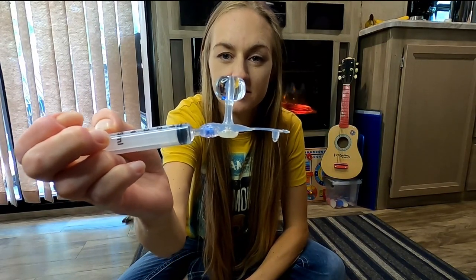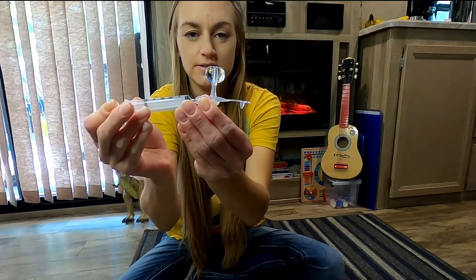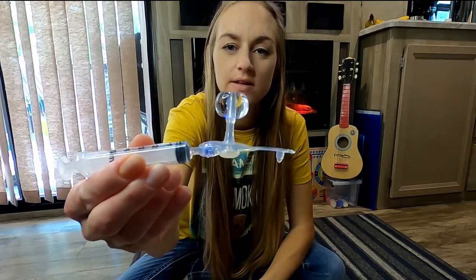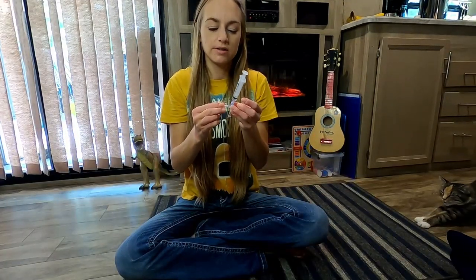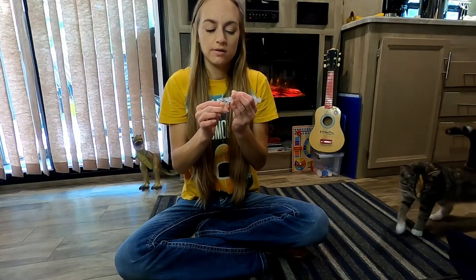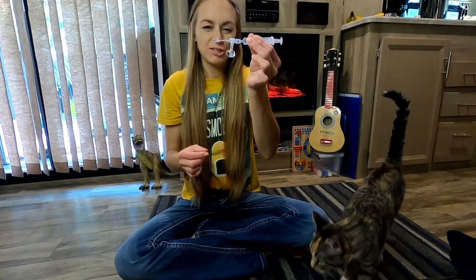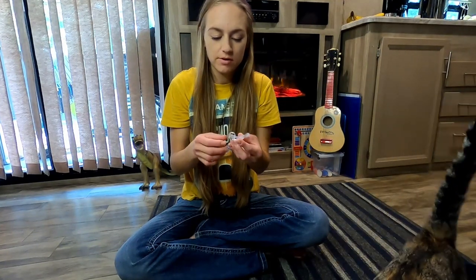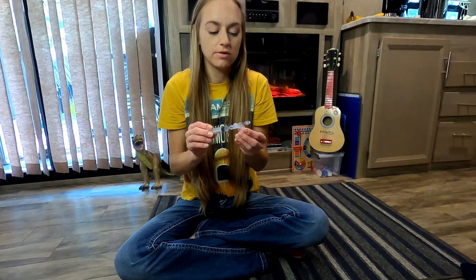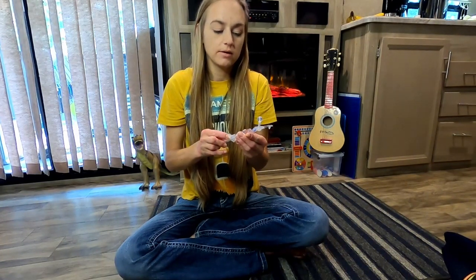That is the full balloon. I like to check it just to make sure everything looks like it's not misshapen. Sometimes the misshapen ones will not stay in the tummy very well. I've heard of them getting pulled out if they're weirdly shaped. But this one looks good. It's not leaking. So we're going to take the water. Looks good.